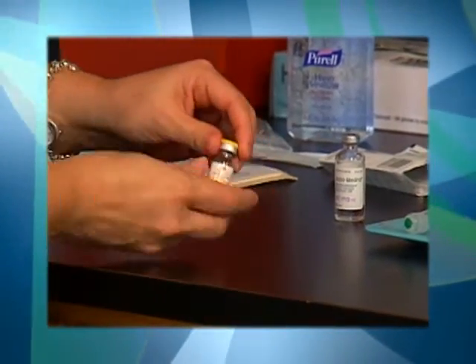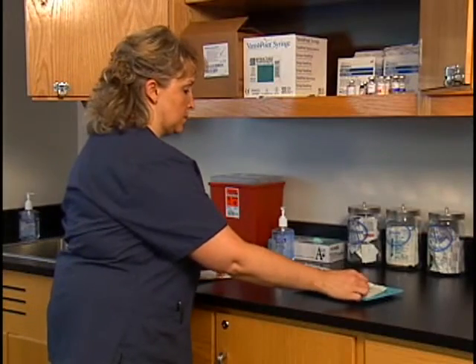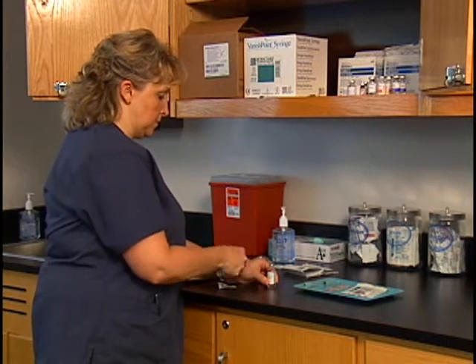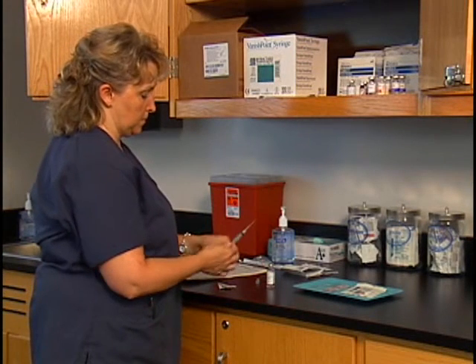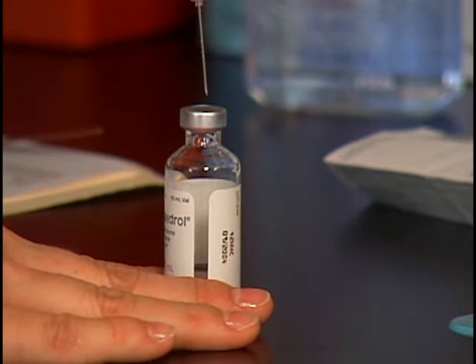If the vial is new and has not been previously opened, remove the plastic or metal cap protecting the rubber stopper of the vial. Open the antiseptic wipe and cleanse the rubber stopper of the vial. This removes any dust or bacteria present on the stopper. You are now ready to withdraw the medication from the vial. Place the vial in an upright position on a flat surface. Remove the needle guard. Pull back the plunger to draw an amount of air into the syringe equal to the amount of medication to be withdrawn from the vial.